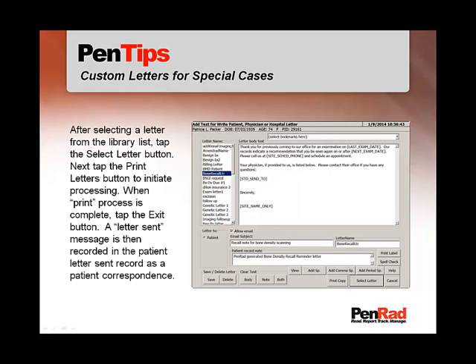After selecting a letter from the library list, tap the Select Letter button. Next, tap the Print Letters button to initiate processing. When the print process is complete, tap the Exit button. A letter sent message is then recorded in the patient letter sent record as a patient correspondence.